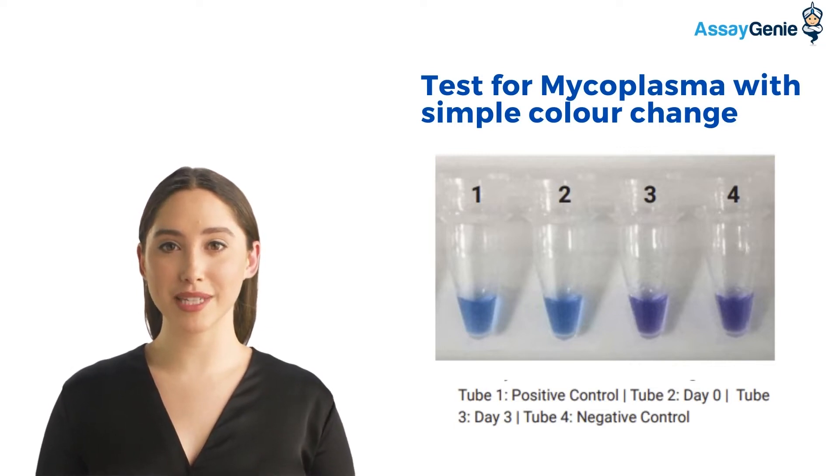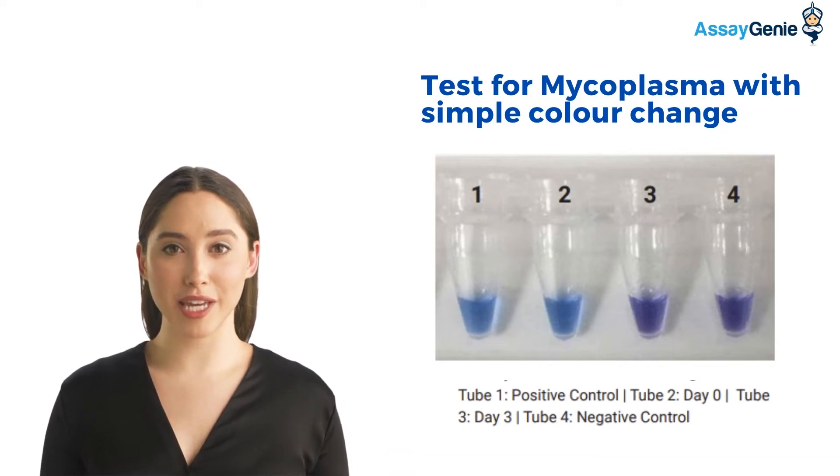Tube 1 and 2 contain mycoplasma. The color change from blue to purple as seen in tube 3 shows that no mycoplasma was detected following treatment with our mycoplasma elimination kit.